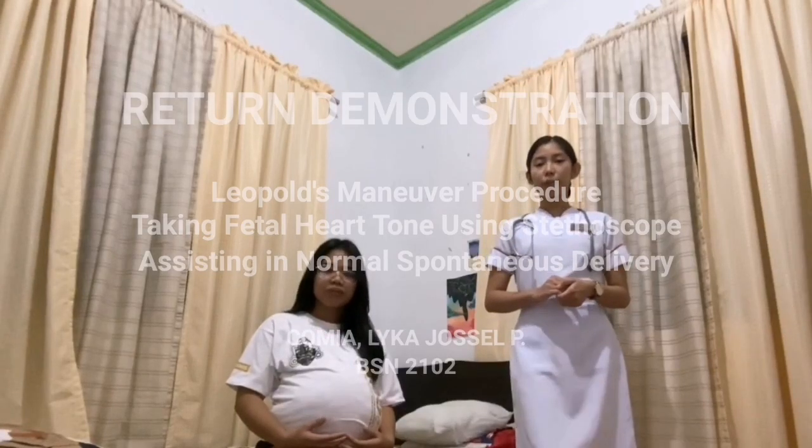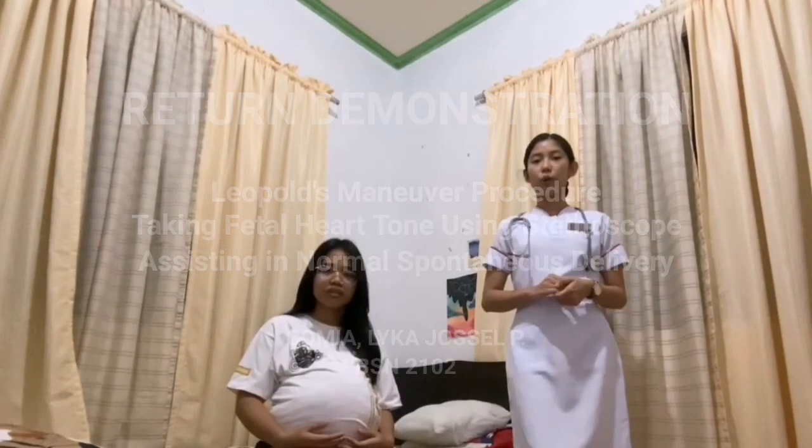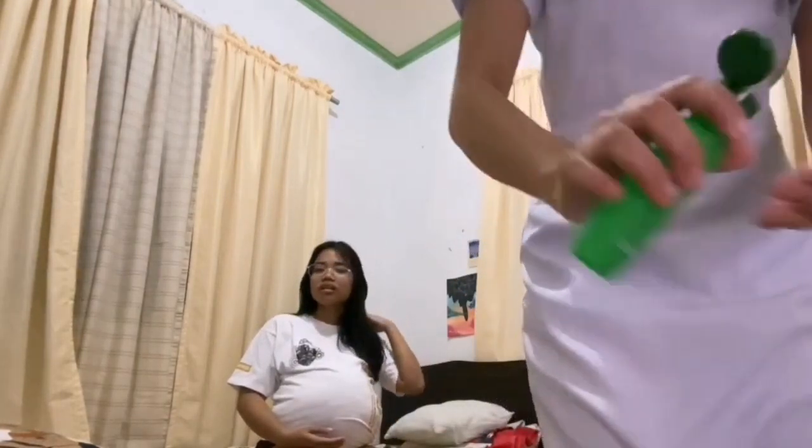Good day, I am Laika Giselle P. Comilla from BSN2102, and today I'll be performing the return demonstration for the Leopold's Maneuver procedure. The first thing I am going to do is to wash hands using alcohol in order to deter the spread of microorganisms.